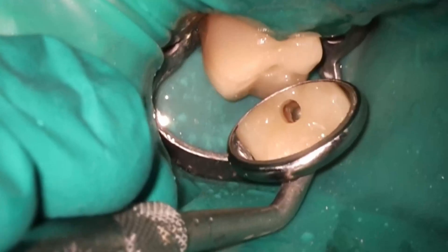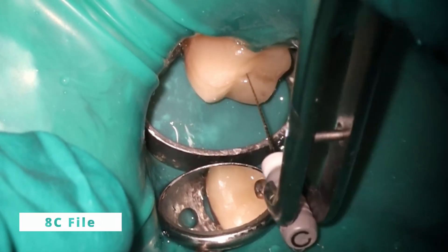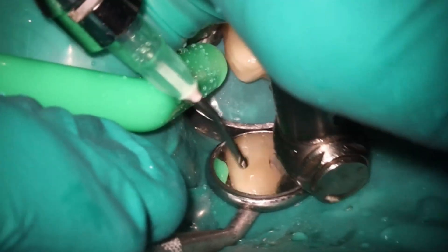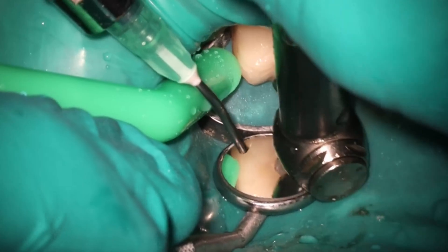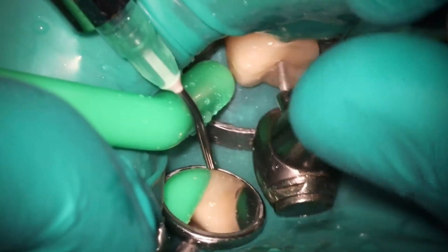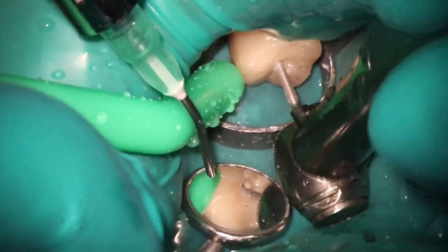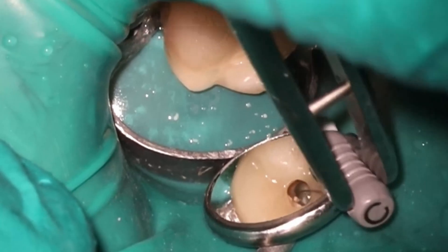That's going to be the access — I don't do too much more as far as widening it. But I do have to go inside the actual canal. I wasn't able to pick out that distal, but the hole on top of the tooth is going to be right about that one and a half-ish size. So very conservative here, and thankfully because of this machine I'm able to feel comfortable doing this in one visit, whereas before it would be two.